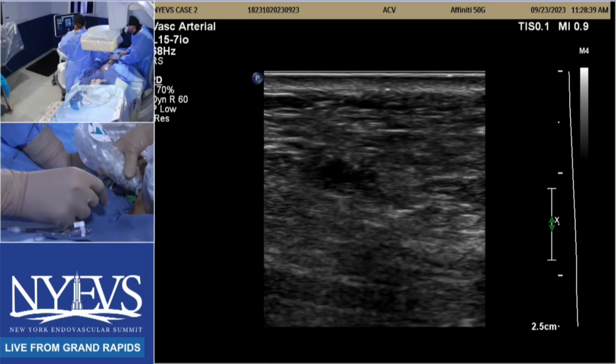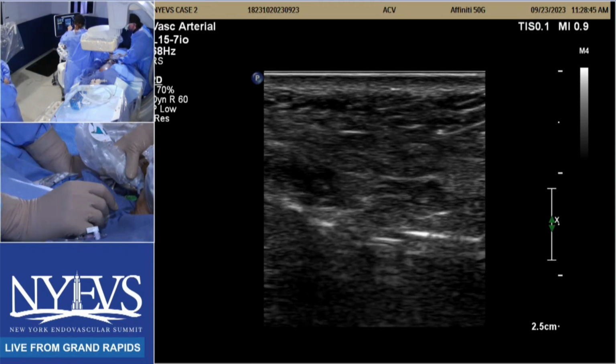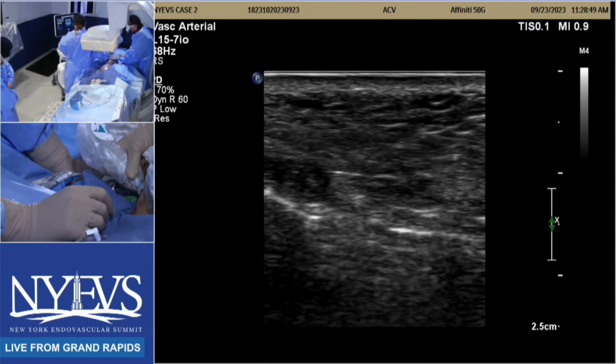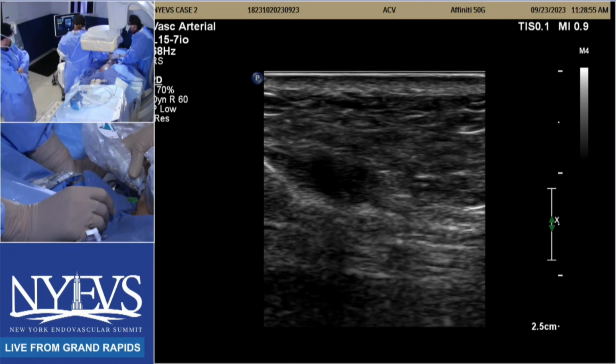But in terms of the ease of the case, for most of us who don't want to tackle very complex stuff, if we have another option, I think it's certainly optimizing the anterior circulation and seeing if something hibernating will pick up, and evaluating clinically. Again, it's minor tissue loss.